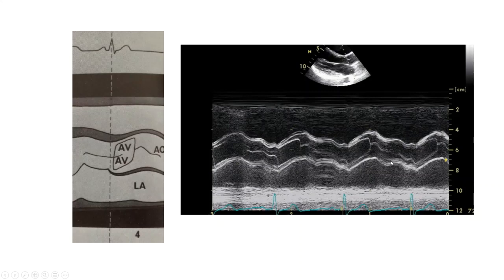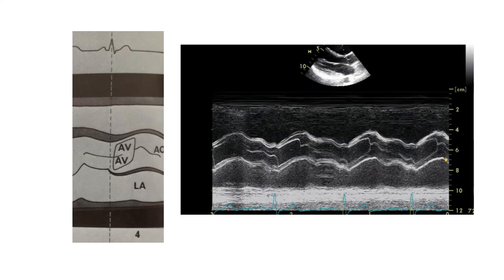The amount of time that the aortic envelope is open — in other words, the ejection phase of ventricular systole — correlates with stroke volume. When this aortic valve envelope is very short in duration, say 200–250 milliseconds, that is either indicative of tachycardia, or if the heart rate is normal (say in the 70s), a low forward stroke volume.